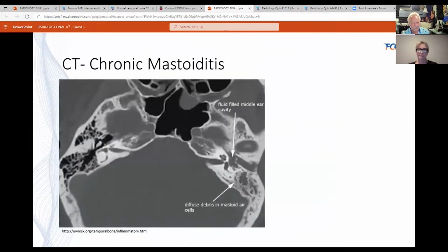All right, so I'm going to go on to the imagery that was associated with a patient like this. This right here is the left temporal bone, so the left ear. And you can see that unlike on the right side, which is normal, like I showed with the ice cream cone right here, the malleus, the incus, and then the air-containing mastoid and middle ear. On this other side, you can see we're not quite perfectly even. But this is the beginning of that ice cream cone, so you know you're in the right place, and we're cutting right through the cochlea here.